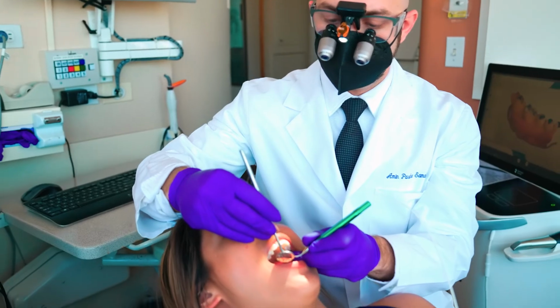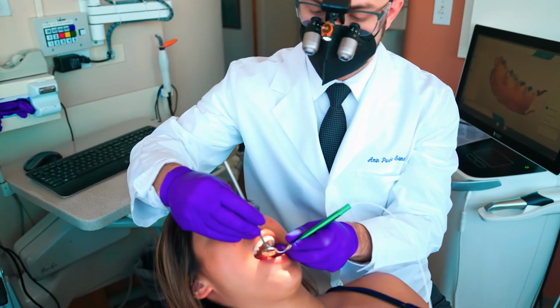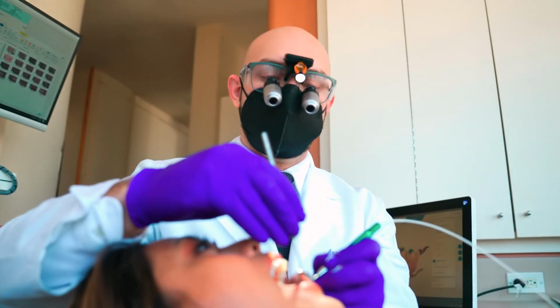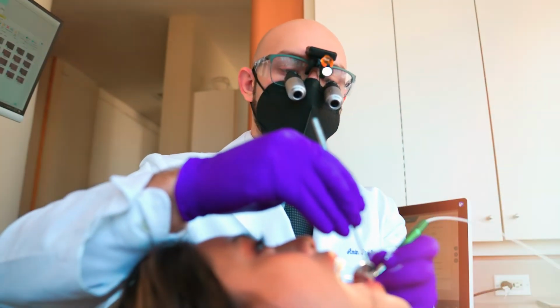The procedure usually takes between 1 to 2 hours depending on how many quadrants the patient needs to do. There's no downtime, but for a full mouth LANAP, we usually have a couple of days that the patient is a little sore. In terms of going to the work, they can go to the work the next day.